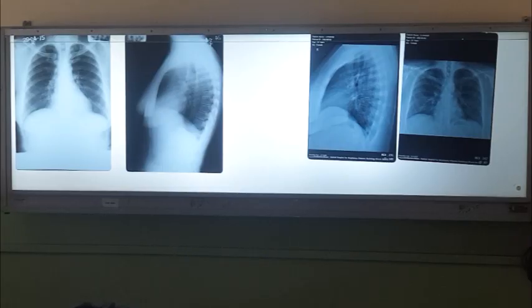So we have a lot of TB patients. At the end of the treatment, we do a chest X-ray and ask them to keep it. So the next time when they come with symptoms, to look for reactivation or to look for some other pathology arising there, you have to have the previous X-ray. You have to keep those two and compare. So all the X-rays are very important. Ask them to keep them, right?